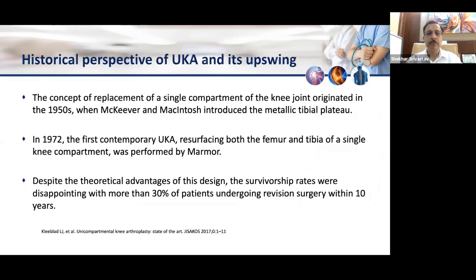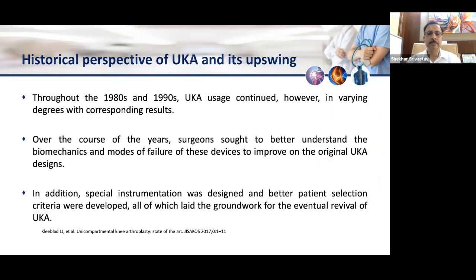Now the concept started in the 1950s when McKeever and MacIntosh introduced the metallic tibial plateau. Then in 1972, the first contemporary UKR, where resurfacing of both the femur and tibia of a single knee compartment was performed, was done by Marmor. Despite the theoretical advantages of the design, the survivorship rates were disappointing, with more than 30% of patients undergoing revision surgery within 10 years.